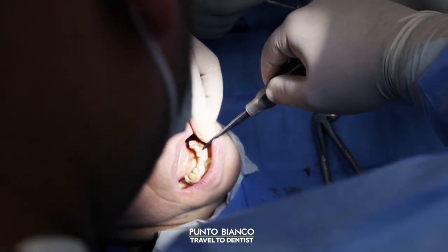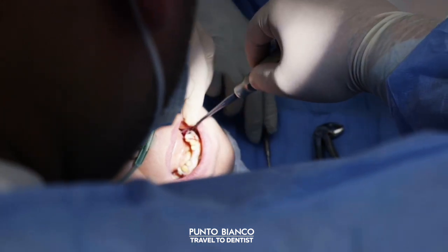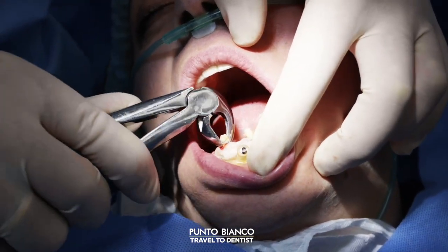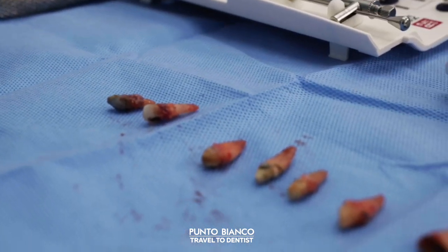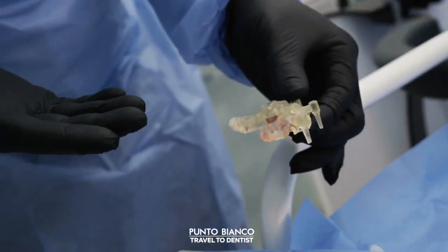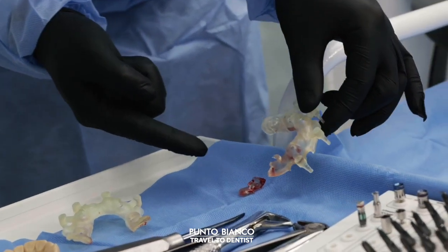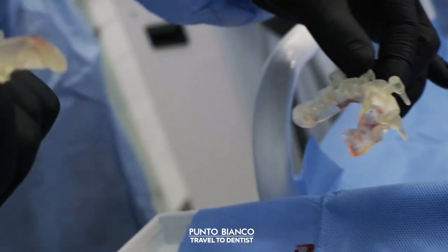So now the doctor has taken out a part of the surgical guide in order to be able to extract the teeth scheduled for extraction. Why is it important to have backup guides? The initial one broke during the operation, so we had the second one and we continued with the intervention without any interruption.